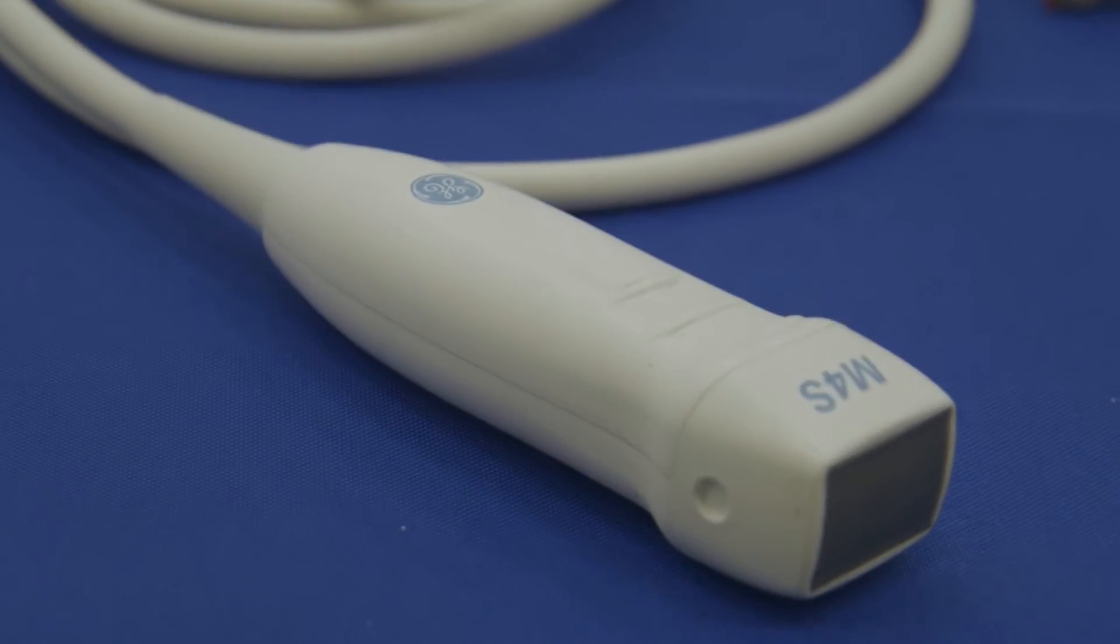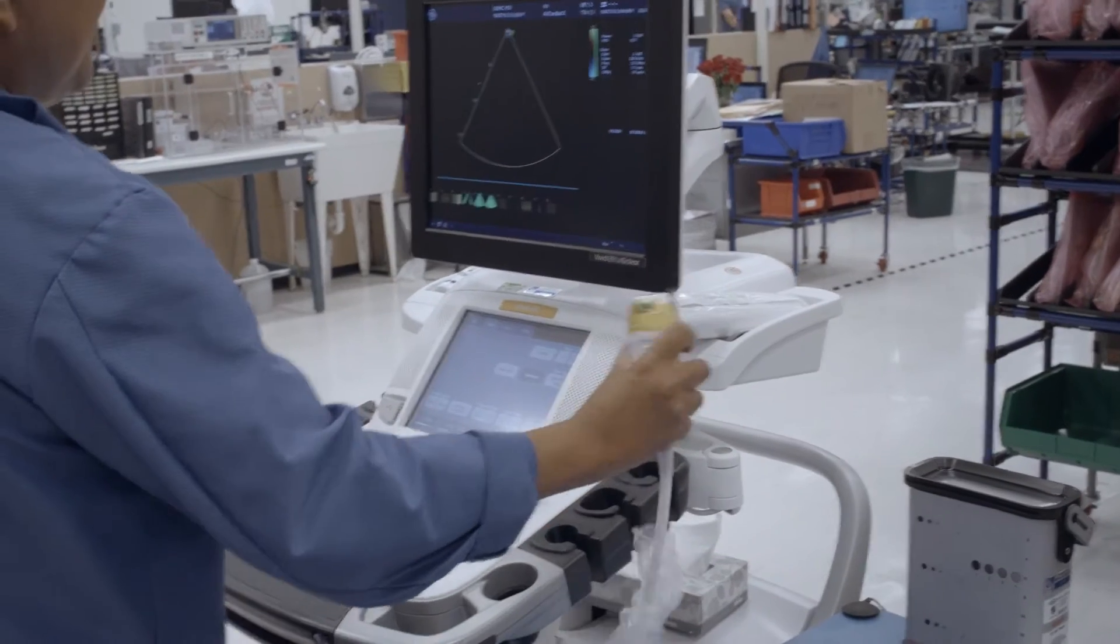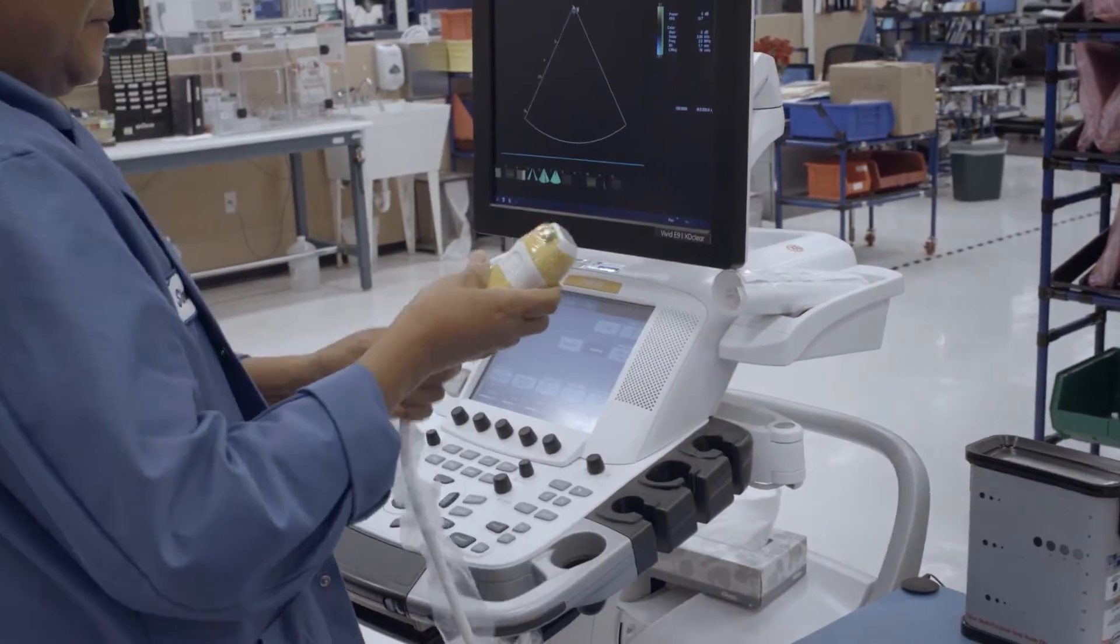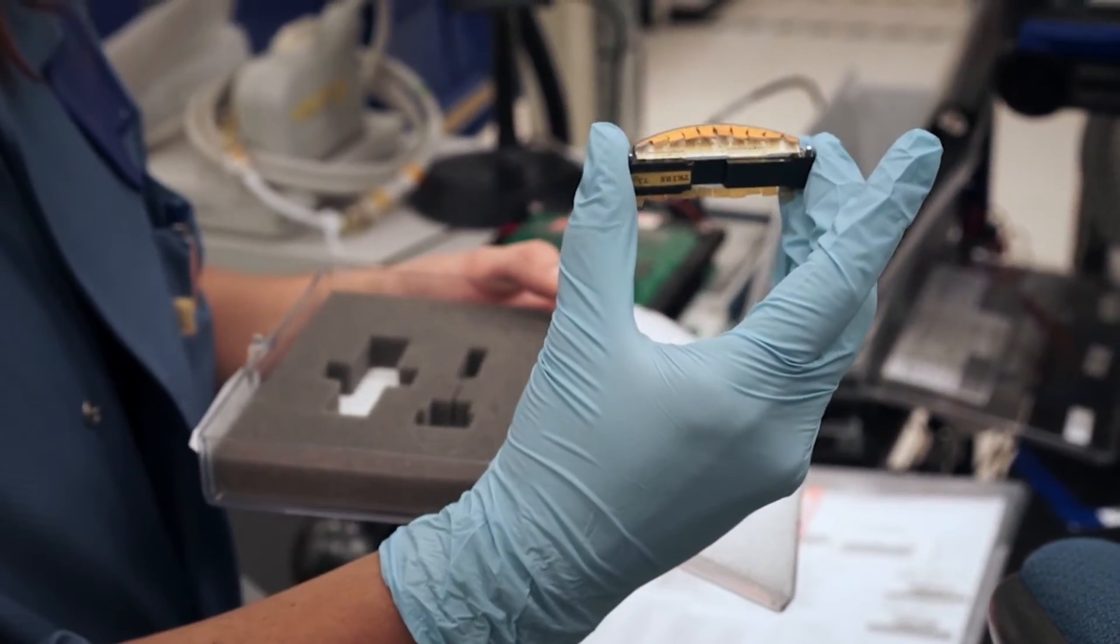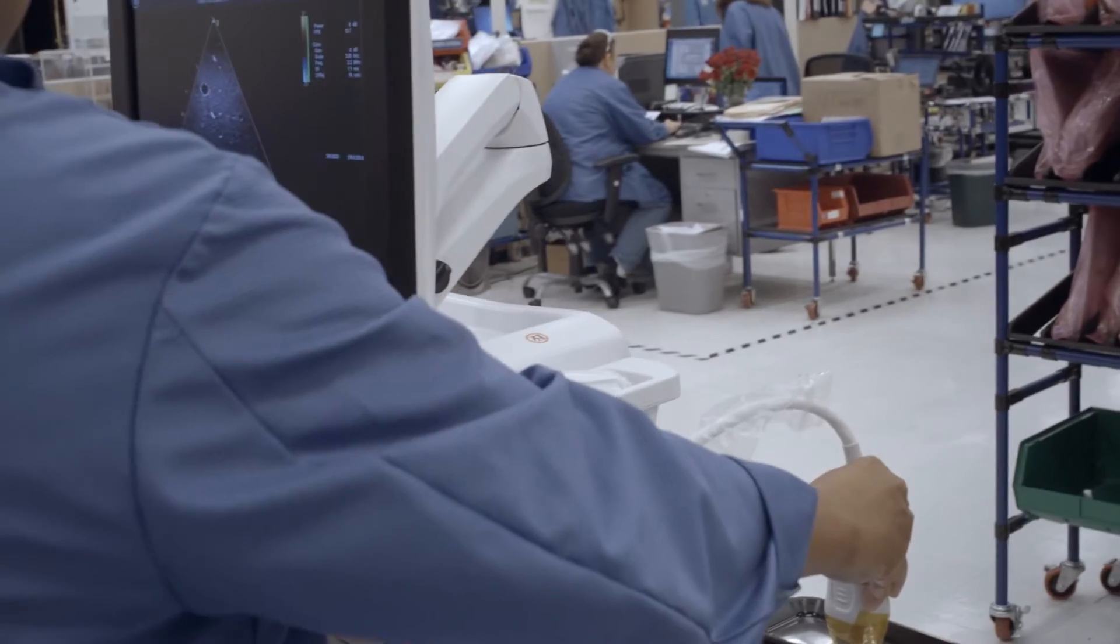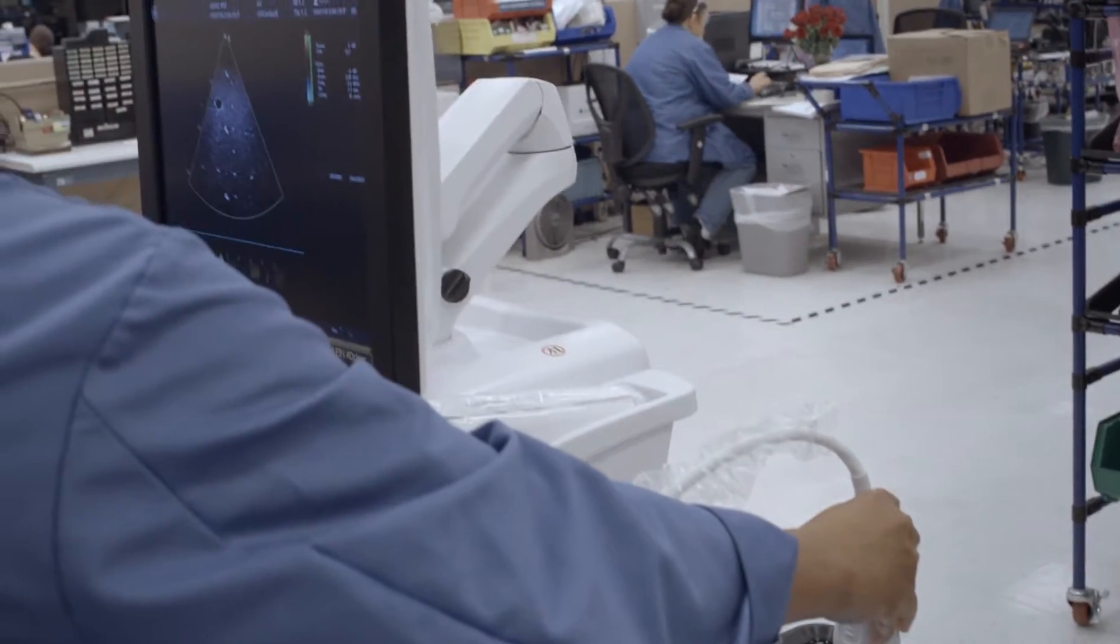We build ultrasound probes that plug into an ultrasound console. We also build the transducers that get built into those probes. The ultrasound probe is what's actually making that image for you. It's what's sending that sound wave out and back to create that image on screen.